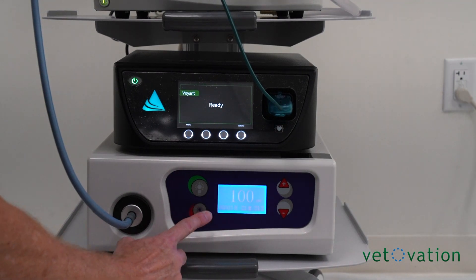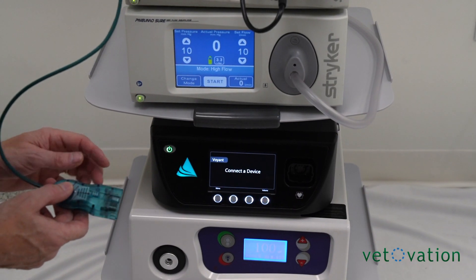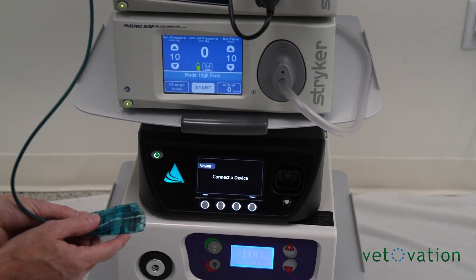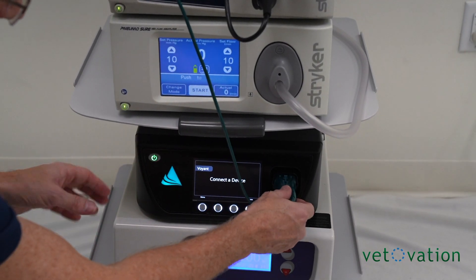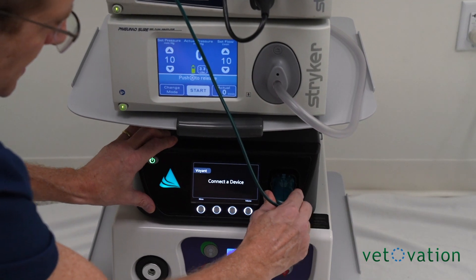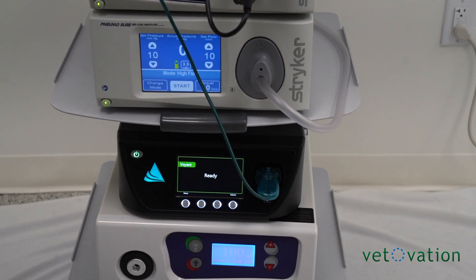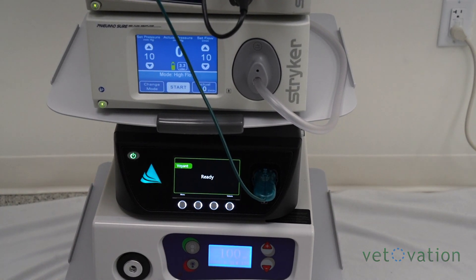For the vessel sealer, when you plug this in, you want to have the little button facing towards 12 o'clock. Once plugged in, your screen will go from 'connect device' to 'check' to 'ready,' and now it's ready to seal.